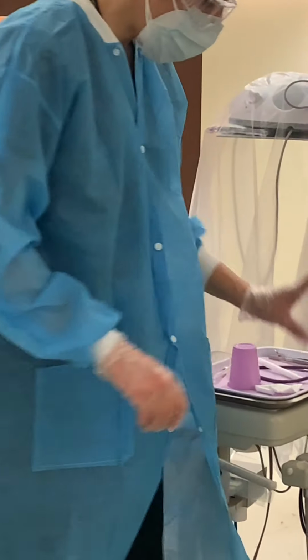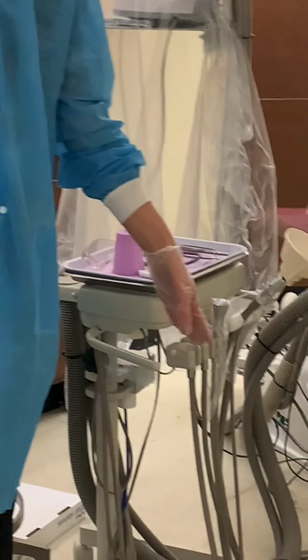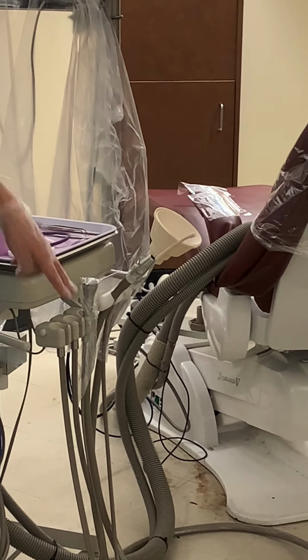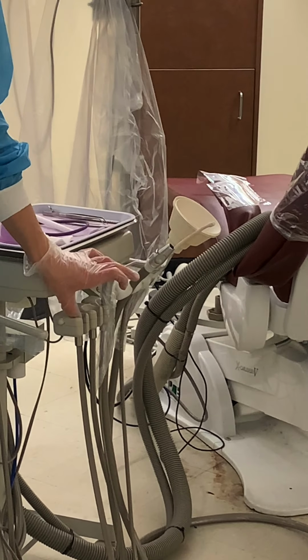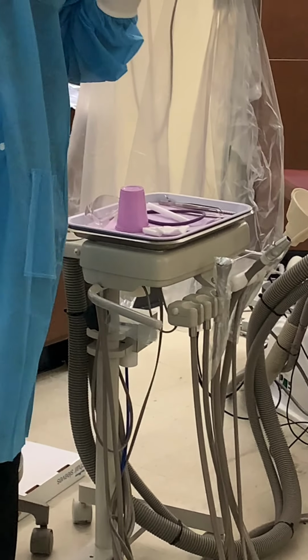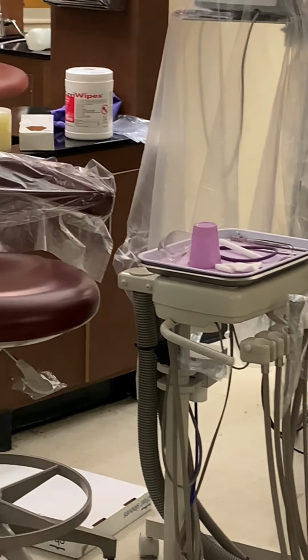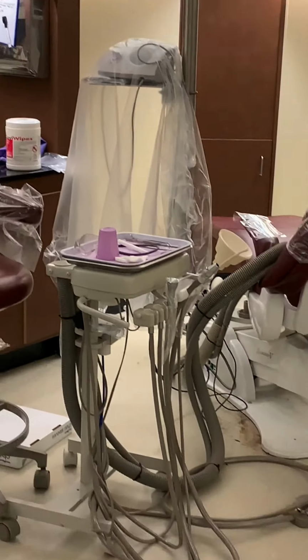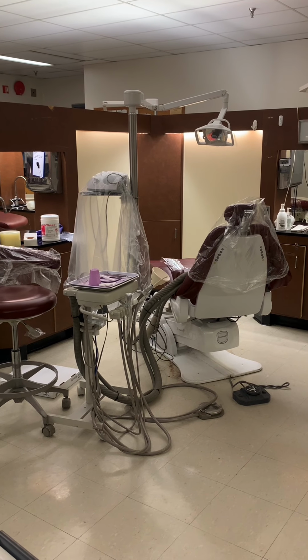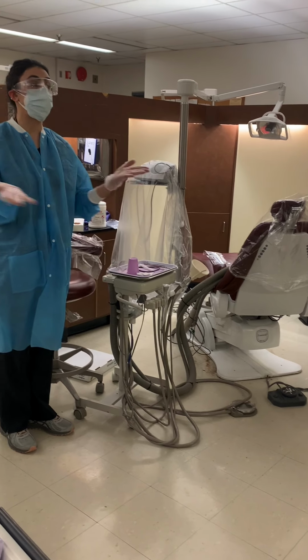When you put hand pieces on here, we wouldn't barrier those because the hand pieces get sterilized. So just so you know, these two pieces just get left like this because the hand piece will go right on here. That's really what's being touched, and that gets sterilized. That goes in the mouth, okay? So as far as infection control on the unit and barriers, the unit is ready for the patient to be brought back and seated because everything here is already nice and clean. So right now we're ready to seat our patient.